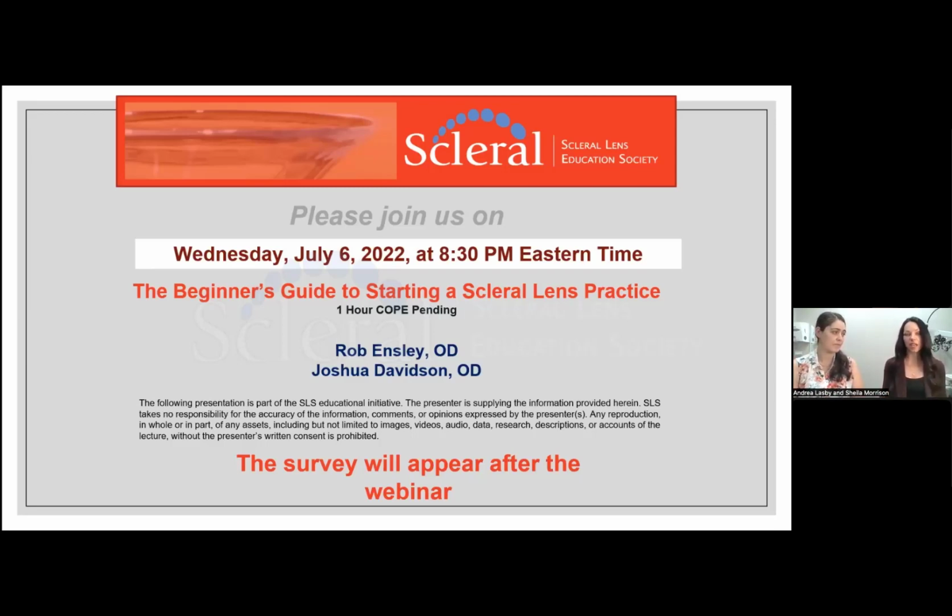Obviously they're doing something. What is the right size? I don't know. There are a couple of labs that I work with on the multiple fenestrations I've been doing that are a little bit smaller, like 0.2 to 0.4 millimeters. I don't know that I work with anybody right now regularly that I have lenses fenestrated larger than about 0.4 or 0.5 at the most. That definitely seems to do the trick, definitely for suction. And I've actually been fenestrating in odd sites sometimes. I would say definitely though, the most common is the 2, so maybe at 2 o'clock, and I guess that would be 8 o'clock, or 10 o'clock, 8, 8's down here.